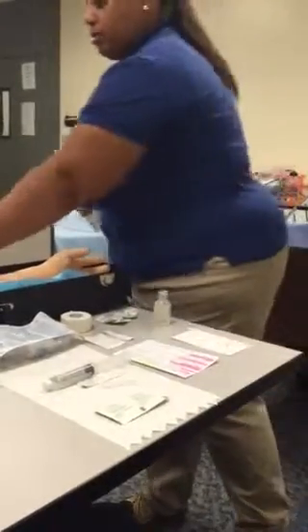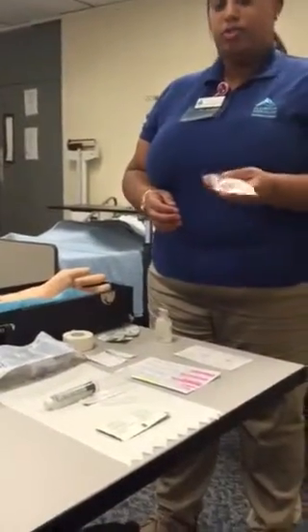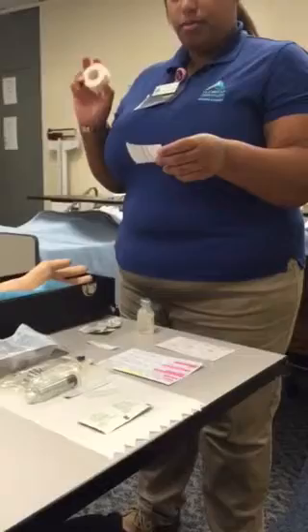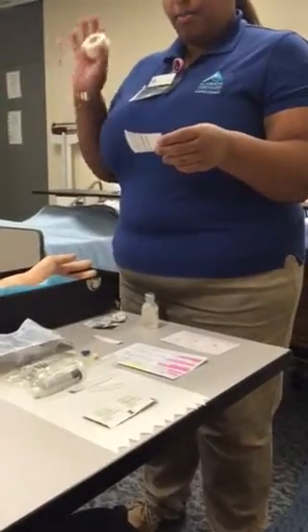Discard needle into sharps. Gently shake bag to evenly distribute medication in bag. Label bag with the patient's medication, the dose, the time, the name, my name, and date.